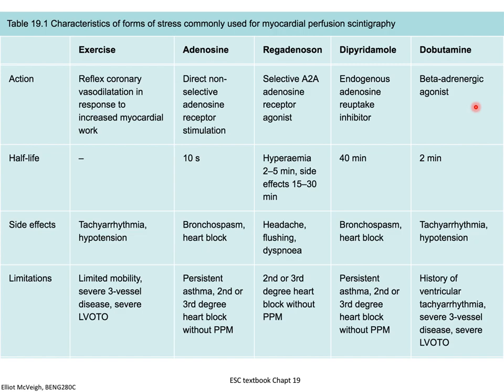This can happen naturally, obviously. Like when you get scared, if for whatever reason you get frightened, your heart will start pounding harder, and that's natural adrenaline. So it can happen naturally, but it's hard to control naturally. You don't want to scare patients into stress. So you inject this drug at specific rates to get it up.